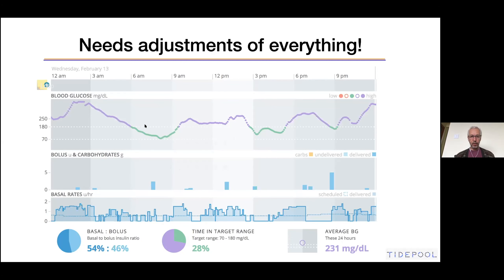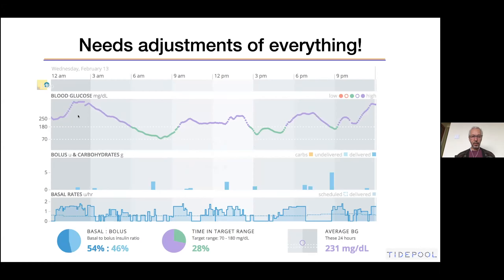Here's a quick example of someone who just started on Loop. Just looking at this — there isn't a single half-hour with just the set basal. It's either more basal or less basal all day long, and still running high most of the time, going up and down all day. This is a patient who started on Loop without optimizing their settings. This is hopefully an example that illustrates one of my passion pleas to everyone: before starting any closed-loop system, do a little bit of adjustments for just one to two weeks to optimize the settings — especially the basal rate settings — before we actually start looping or doing any automated insulin delivery.